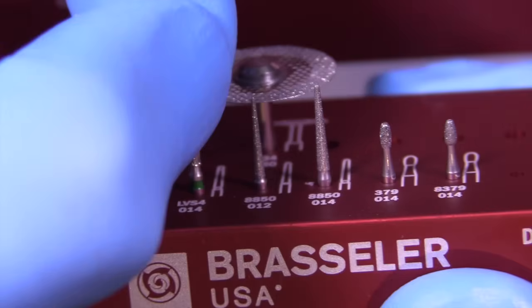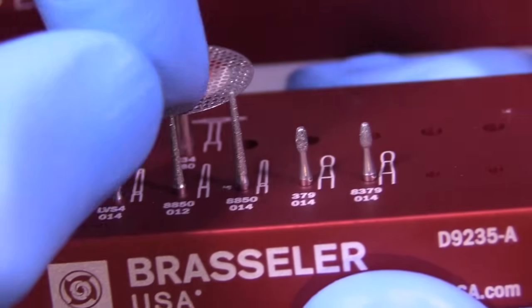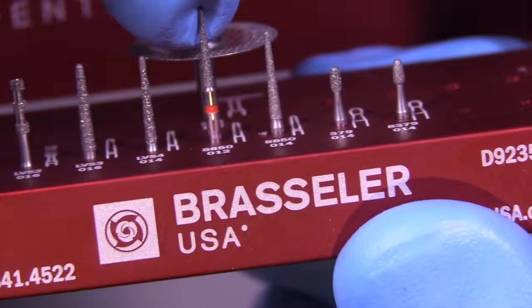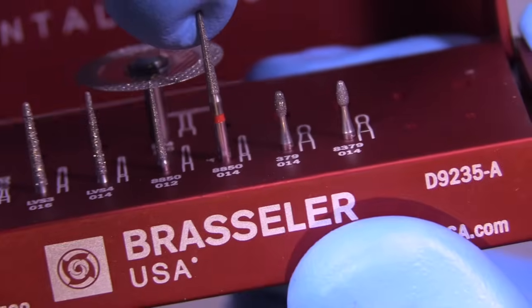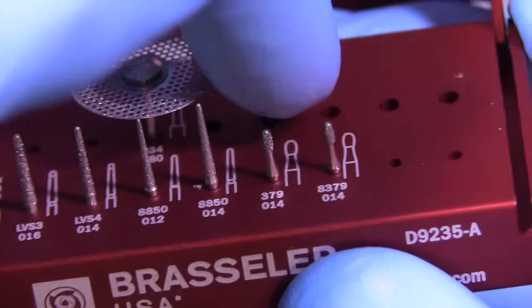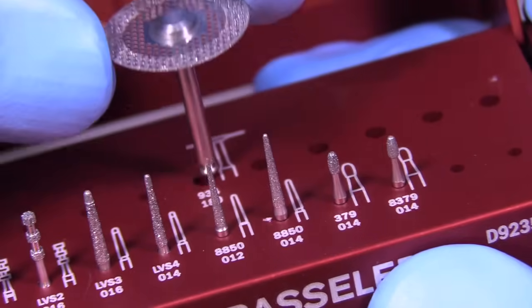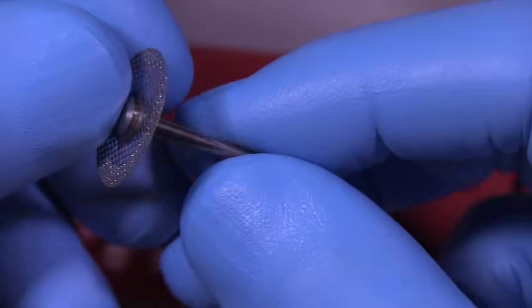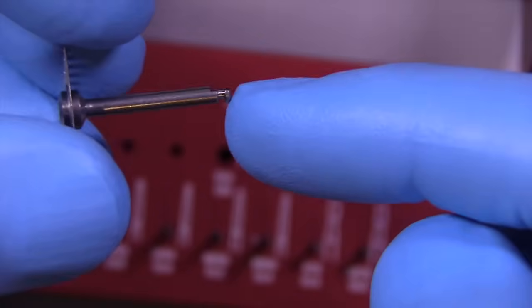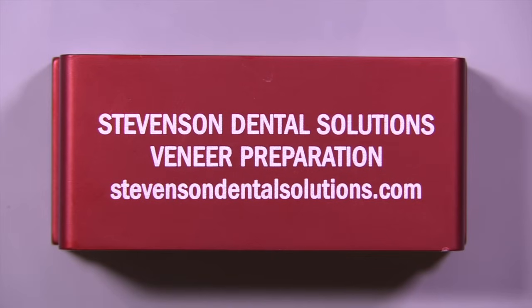We're going to also need burs that are specialized to remove enamel but also be very delicate at the gingival. And then we're going to want to have some finishing veneer burs that are diamond grit of 30 micron and can smooth well, and then of course some burs that can be used on the lingual. And I've got this disc in here, which is a diamond disc. It's quite thin, 180 microns thick, and this can be used for interproximal preparations when those are required.